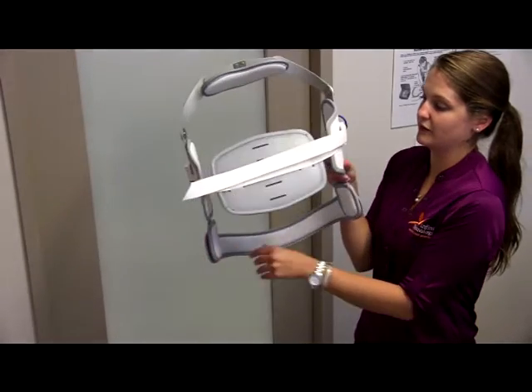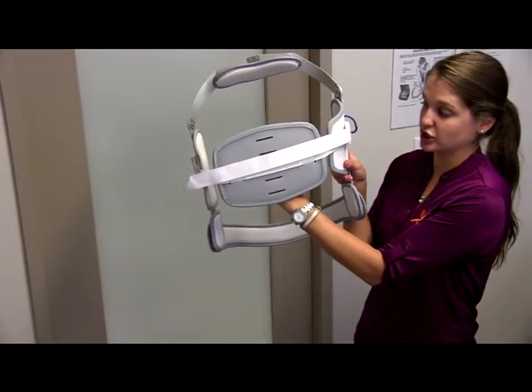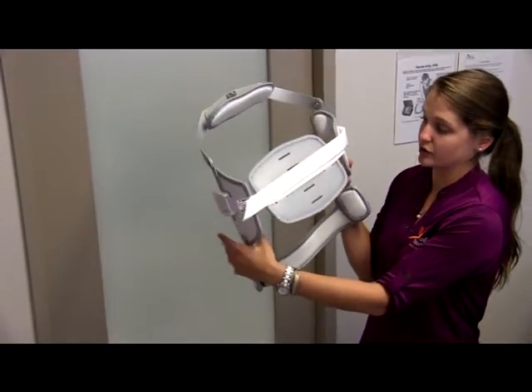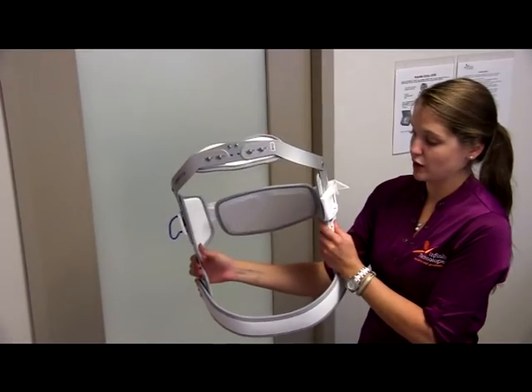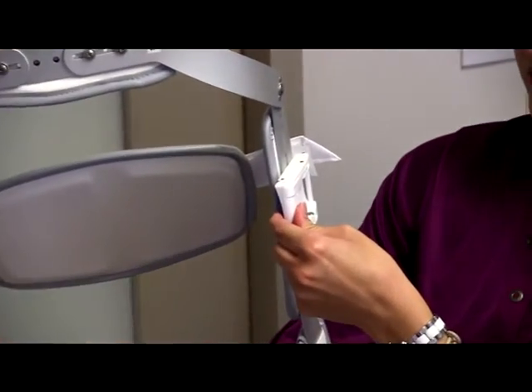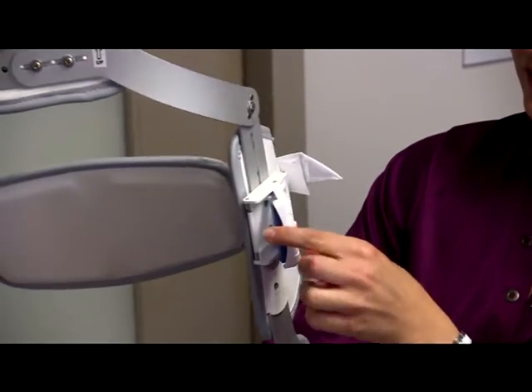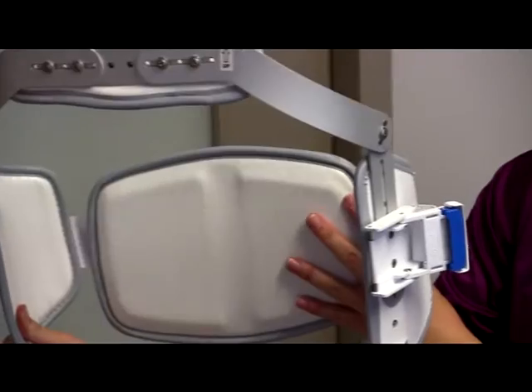Looking at the back of the brace, there's going to be a pad that comes across the middle of the back of the patient, and it's connected to a strap that goes across the side. In order to take this strap off, we're first going to squeeze the blue button on the left side of the brace. That allows us to unlock and unlatch the left side, putting a little bit of slack on the strap.